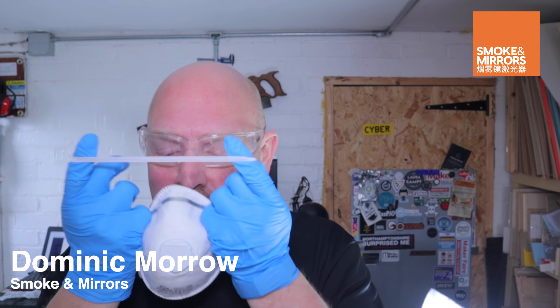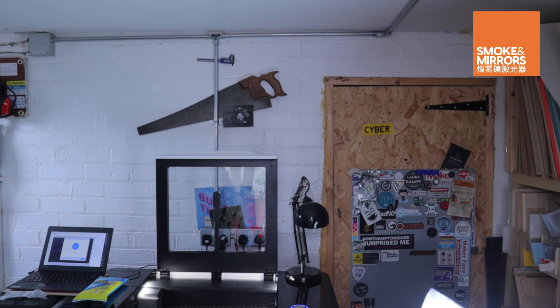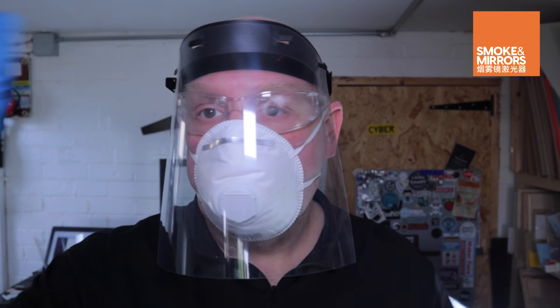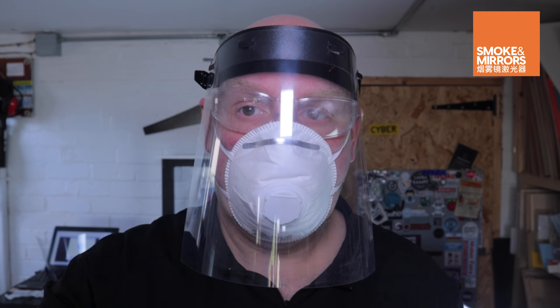Hello, I'm Dominic Morrow from Smoke and Mirrors. Based on requests from our local GP Alliance and reports in the media, Gitronic, Smoke and Mirrors and the Nottingham Hackspace have come together to create a laser cut design for a Covid-19 face shield for use as personal protective equipment by frontline medical personnel.